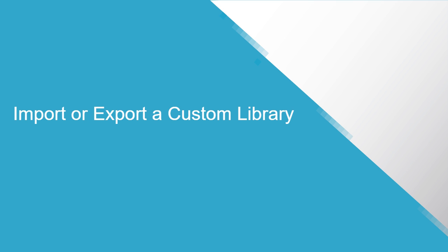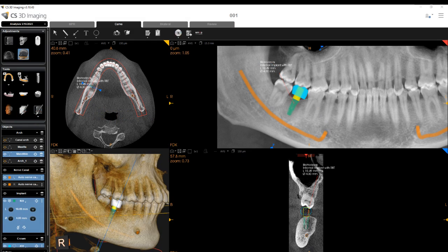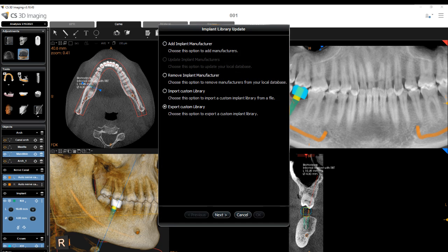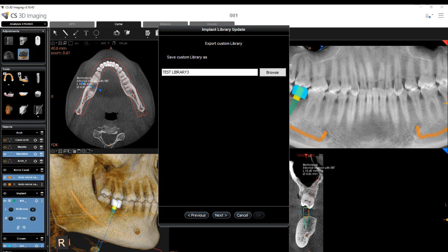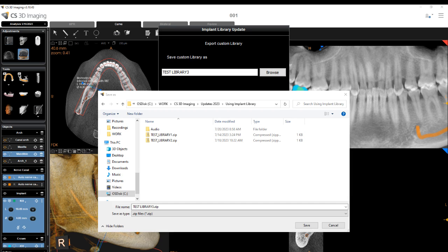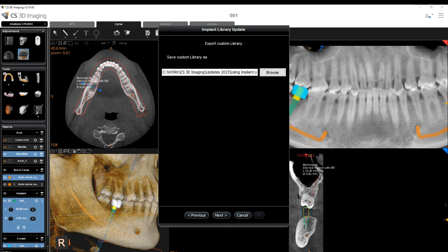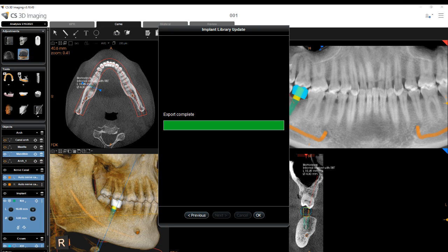Import or export a custom library: You can only export implants you have created — you cannot export manufacturer's implants. The exported library will be saved in zip file format. Open the Implant Library update window, select Export Custom Library, and click Next. Click Browse and select the folder in which you want to export the zip file, and enter a name for the zip file. Click Next. The file is exported. Click OK to finish, or Previous to return to the Options menu.